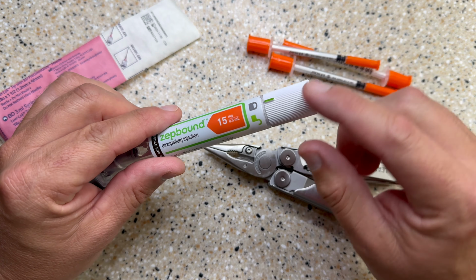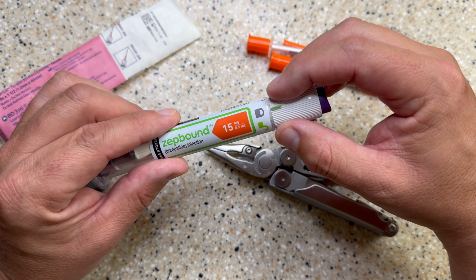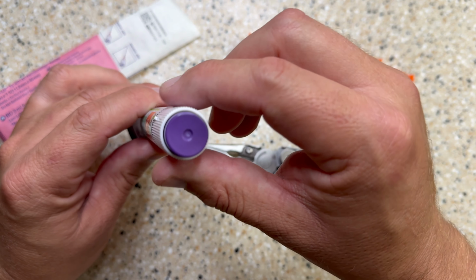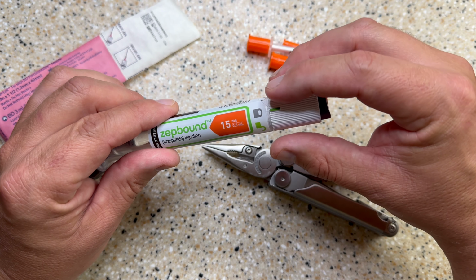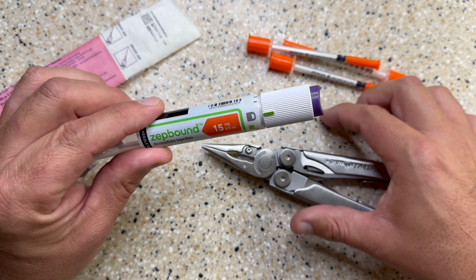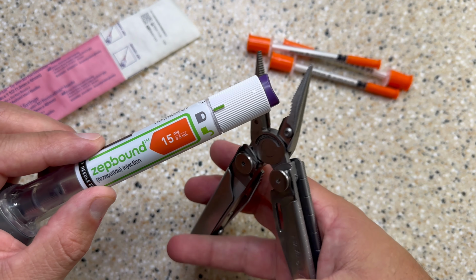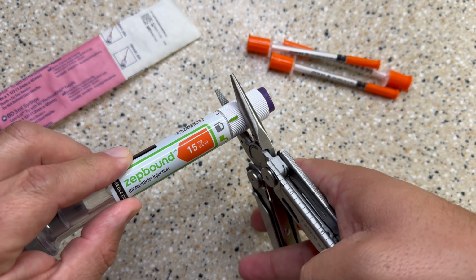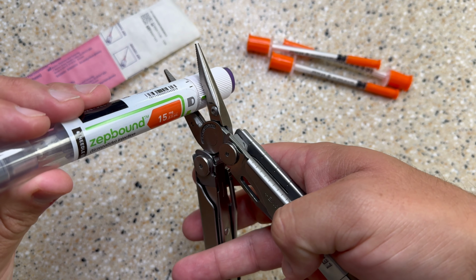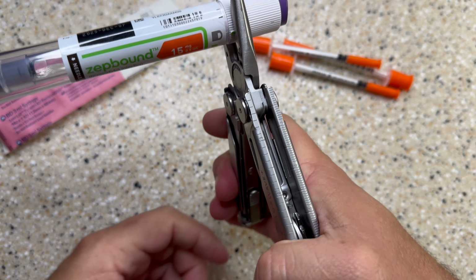Of note here, there's two different symbols. There's unlock and lock. We are going to turn it away from the unlock. So if you're looking at it this way, it would be clockwise. So we're going to grab and rotate clockwise while pulling out with the pliers. So I'm going to see if I can get a close up while I'm loading it here. What I'm going to do is lock this here and go. Channel locks are much easier.